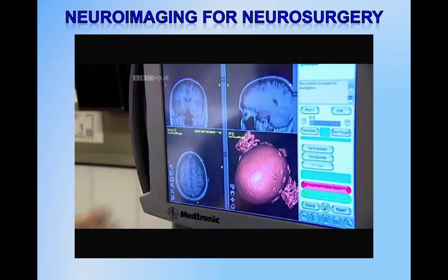Now, Catherine, what you're going to get here now is every now and then you're going to hear a little buzz. Right. The danger with operating on the brain is that it's easy to cause collateral damage. You could leave an arm or leg permanently paralyzed. Okay, yeah. Do a little buzz every now and then, okay? Okay. Yeah. Anything at all? No. Same again. Same again. Oh, yes. Andrew is stimulating Catherine's brain with an electrode to identify precisely the areas that control sensation and motor skills. Okay, fine. Let's go to 1.5. That's good. Same again, Catherine.